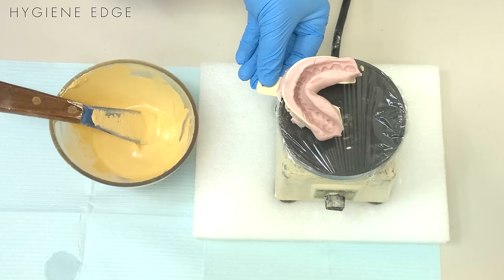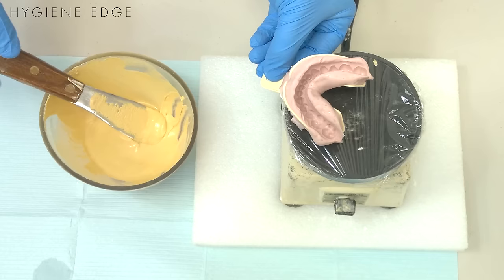The first thing you want to do is grab your impression in your non-dominant hand and place it on the edge of your vibrator. You're also going to use your spatula in your dominant hand.